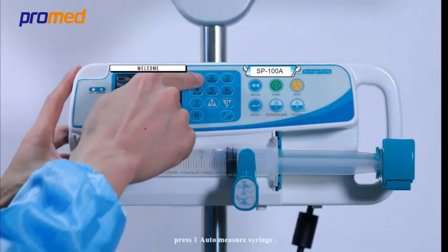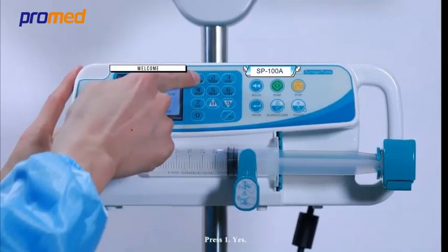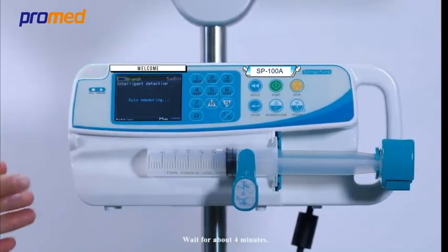Next, press 1 for auto measure syringe, then press 1 to confirm yes, and wait for about 4 minutes.